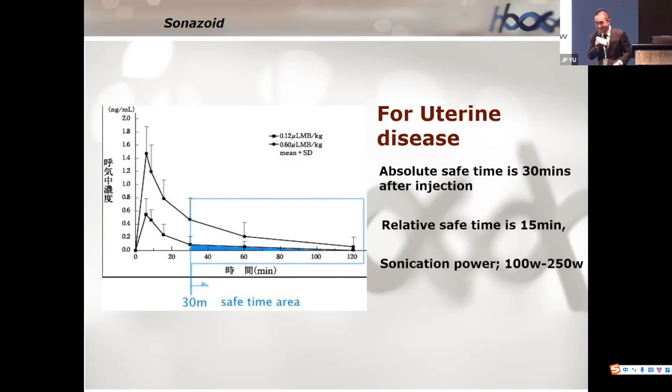So how do you explain your short ablation time with Sonazoid? We usually take 60 minutes, maybe 80 minutes or 1 hour to do a fibroid, but your timing is much shorter, you said, with your Sonazoid. Why is that so? Because you get a faster grayscale change? Is that the reason?